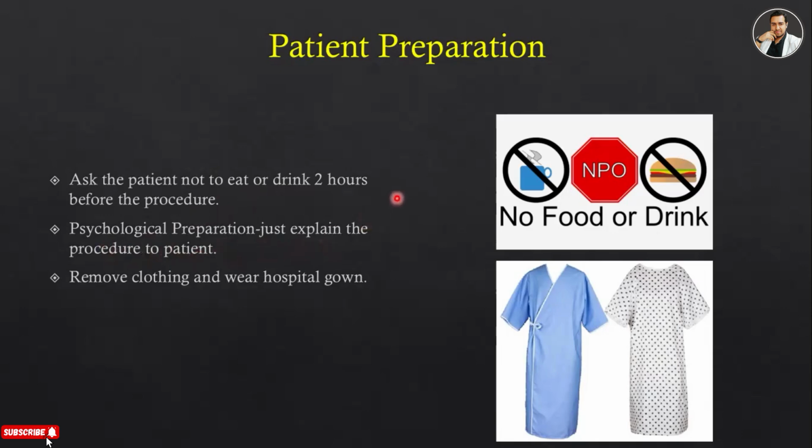Explain that you have to swallow some kind of paste, and it's a little bit sweet in taste. So explain the procedure and when to swallow the paste, and what he should do if vomiting comes. This will be explained.